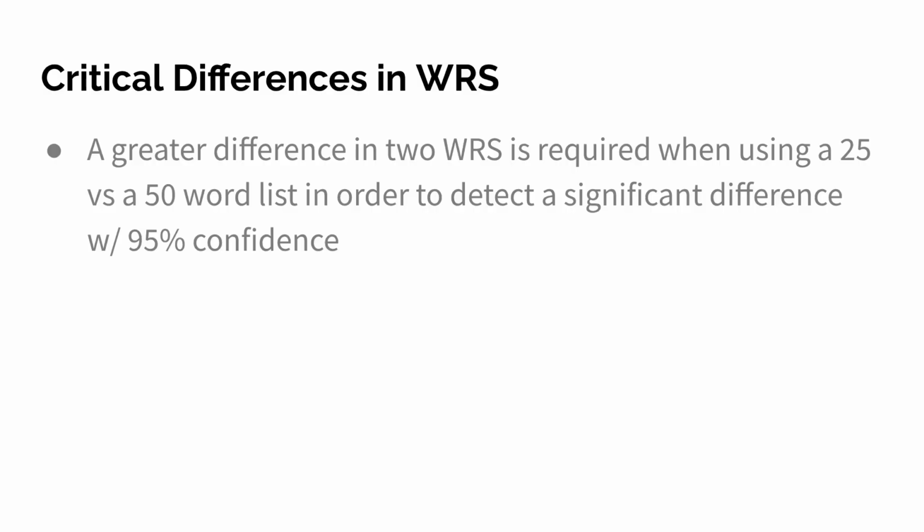What you'll see is you've got a list for 10 items, 25 items, 50 items, and 63 items. 63 items is just a 25-word list scored as phonemes. So what you'll see is a number on the left-hand column going from 0 to 49, and then on the right side you see a column going from 50 to 99.